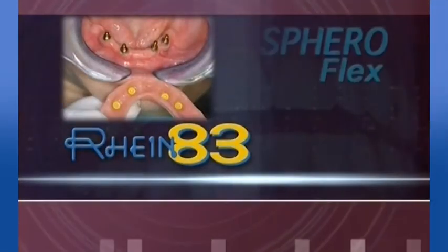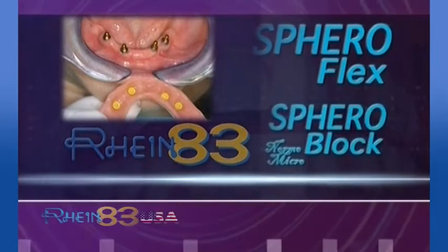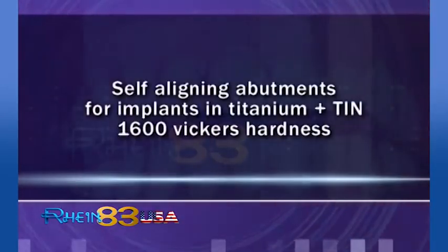Overdenture implants. SpheroFlex and block attachments. Self-aligning abutments for implants.